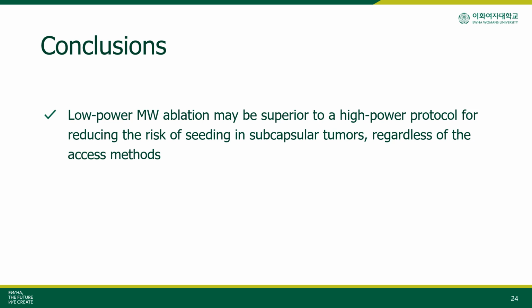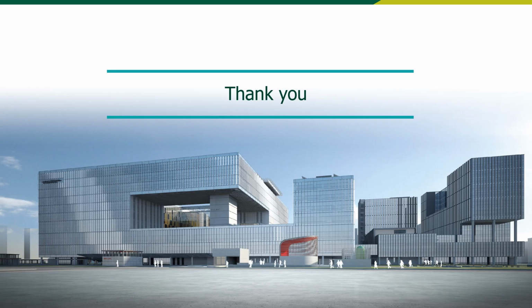In conclusion, low-power microwave ablation may be superior to a high-power protocol for reducing the risk of seeding in subcapsular tumors, regardless of the antenna access method.